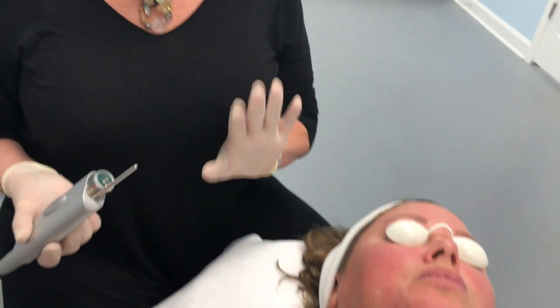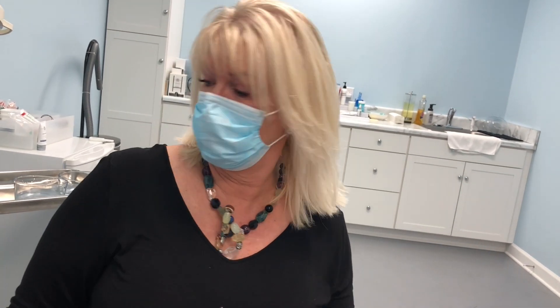Again, about eight passes over the entire chest, neck, and face area.